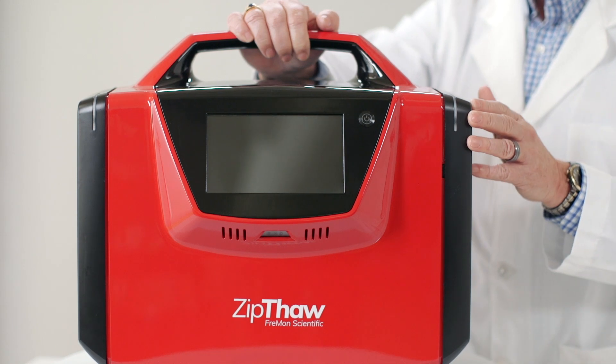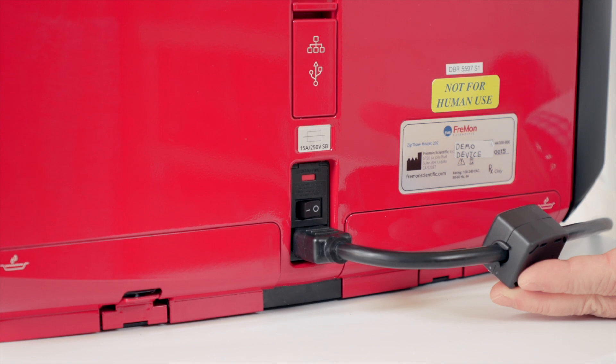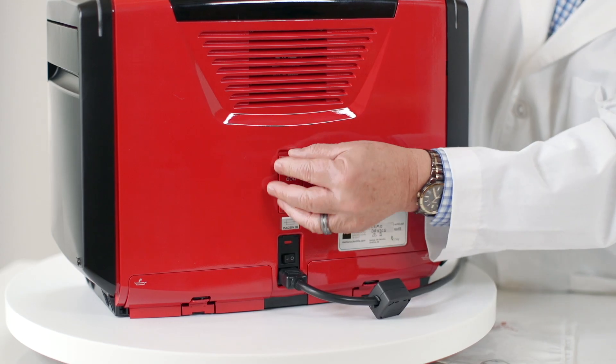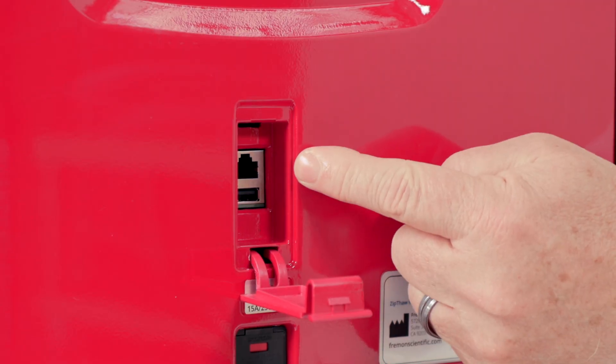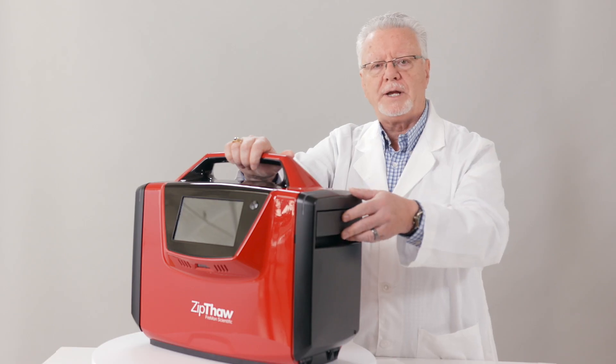Orange indicates ready and thawing, and green indicates finished thawing. This is the back. Here's the power plug, the main power button, the USB and Ethernet data ports, and two spill trays.